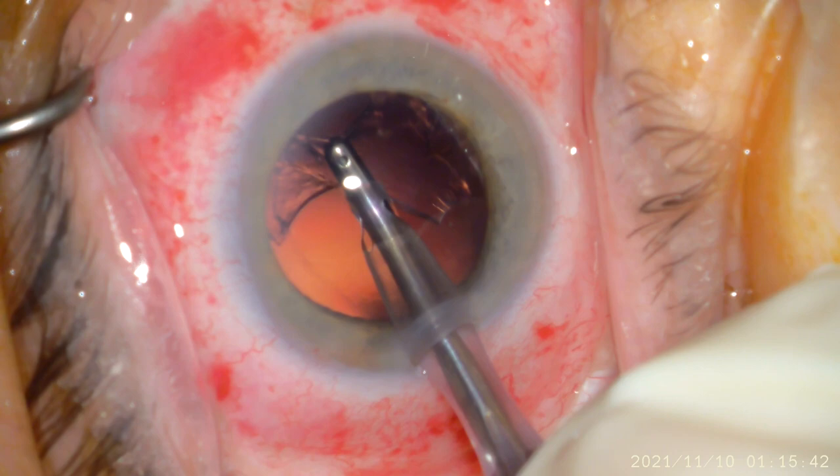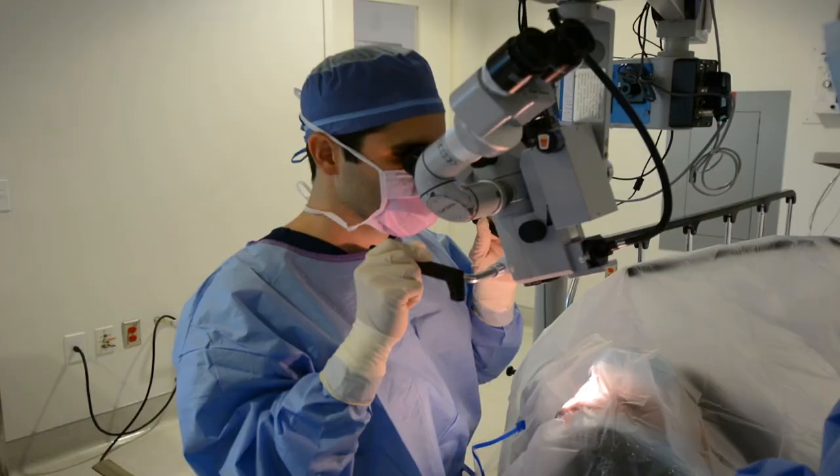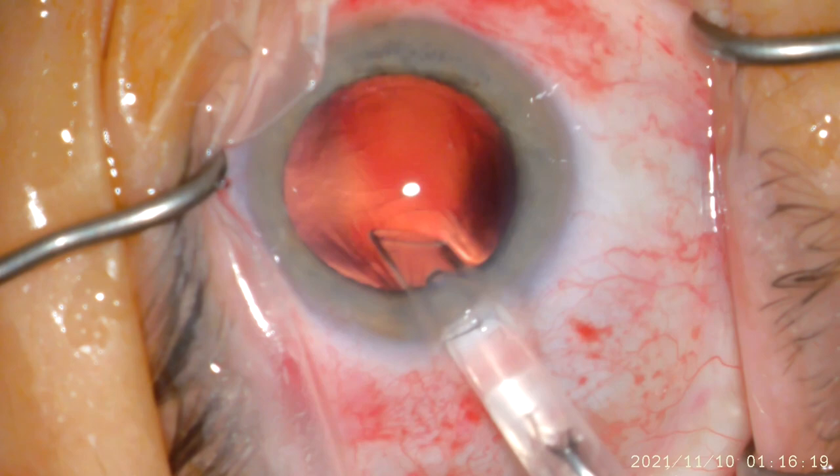Next, you will see that I am introducing another handpiece called the Irrigation Aspiration, and this is used to suck out the sheet-like remnants of the cataract called the Cortex. I want to remove every last piece because this will ensure picture-perfect vision for you.